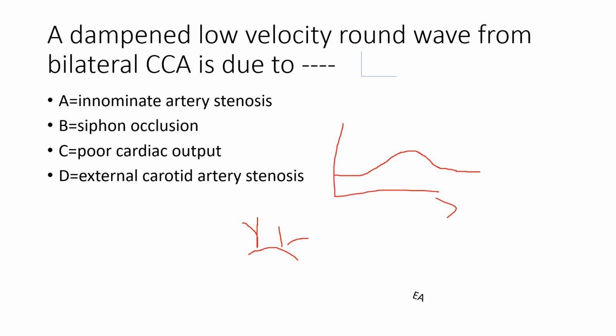So where is the stenosis, or where is the pathology? Innominate artery? No, we have innominate on the right side only. Right side innominate, or brachiocephalic artery. So it is not the answer.